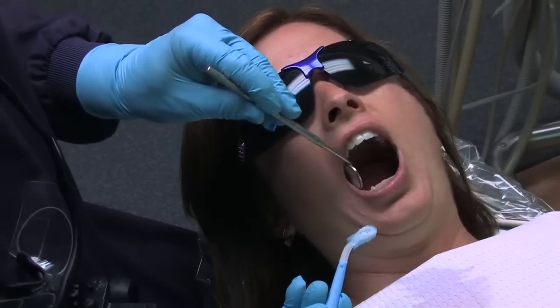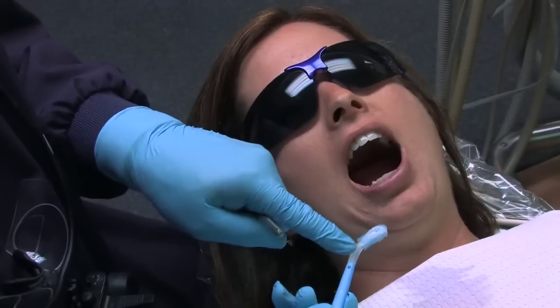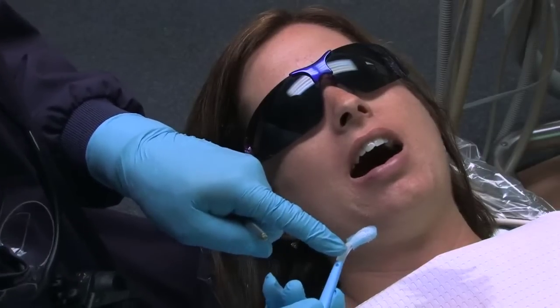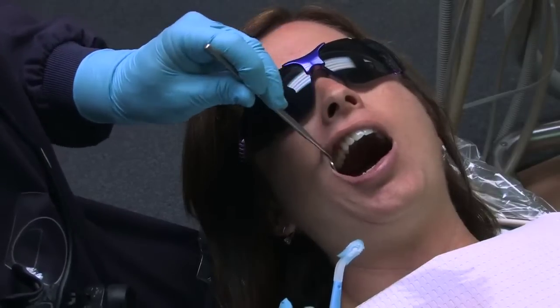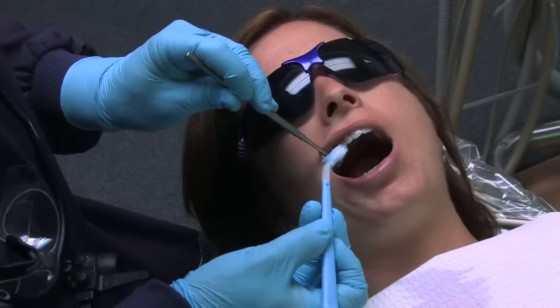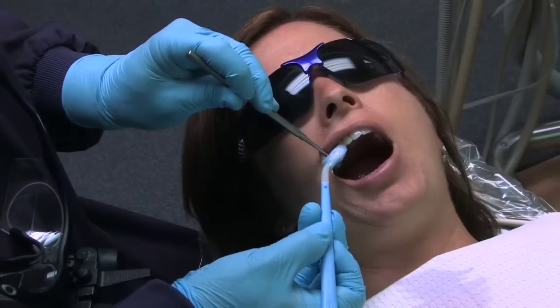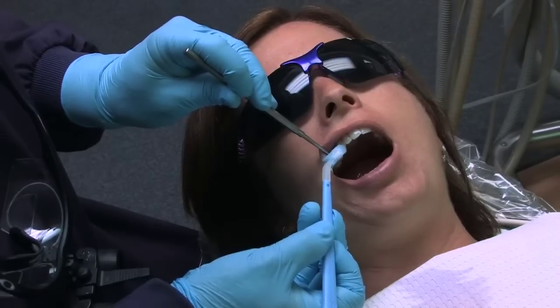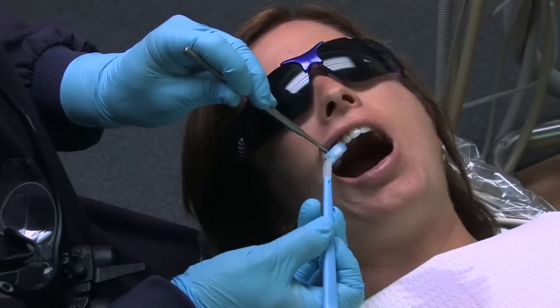Now we are ready to test some teeth. The EDX has a contra-angle design to the handle which allows you to test teeth in the posterior region. To test teeth, apply the cold foam tip to the teeth with light pressure. Additional pressure may be applied if needed. When the foam tip is charged appropriately with refrigerant, it will remain cold long enough to test multiple teeth without recharging.